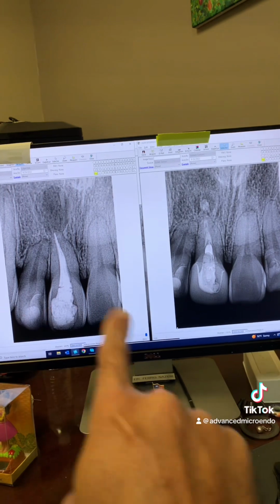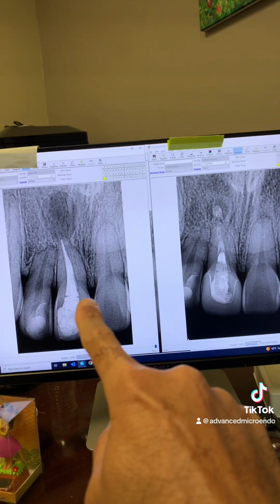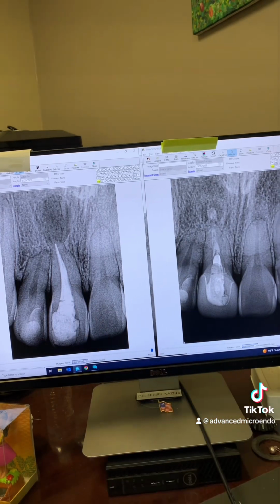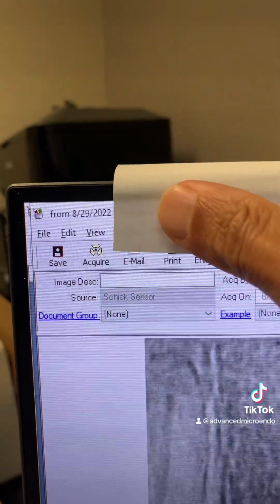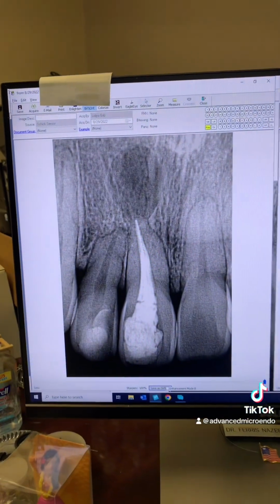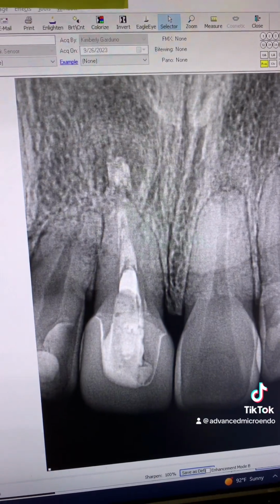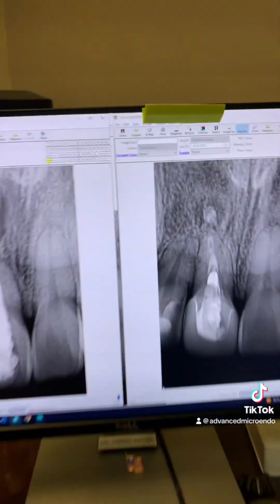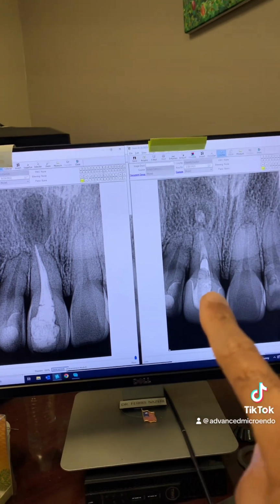This is the side by side 1 year ago before we did the root canal. This is how the patient presented to me for consultation for endodontic retreatment 1 year ago. And here's the date. I'm just covering her name. So as you can see, before we redid the root canal for her in one appointment 1 year ago, and this was just now, 1 year post-op of tooth number 8, and here's the date as you can see today, just now. If I zoom out, you can appreciate what we were able to accomplish.